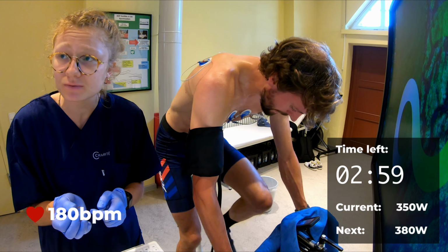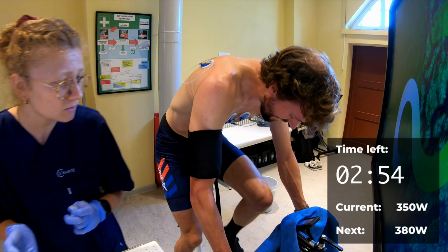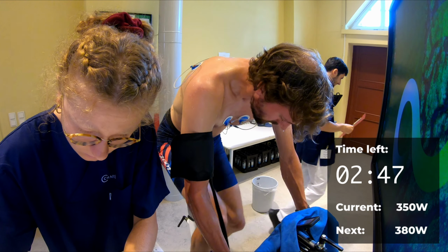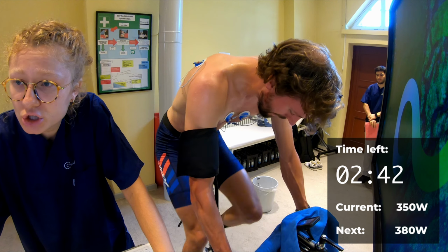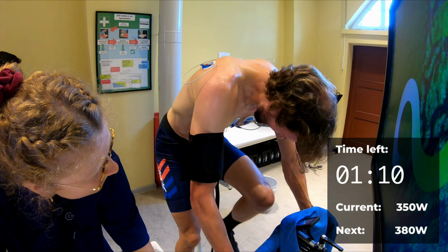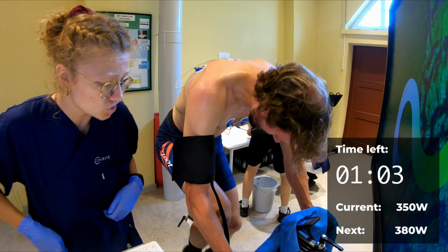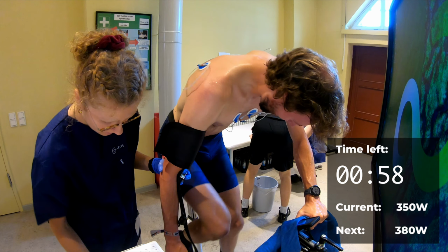2, 1, 350. You have to push at least for 30 to 1 minute. When it counts, still looks so good. Just keep pushing. You can do it. You know it. There's still something inside. Yes, keep going. I have to measure your blood pressure again. Just keep pushing, you can do it.